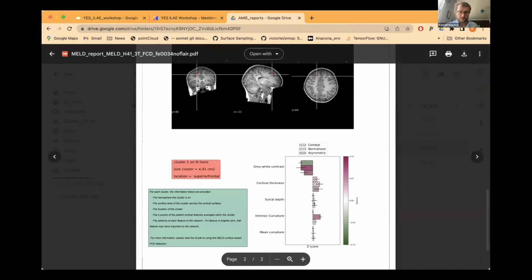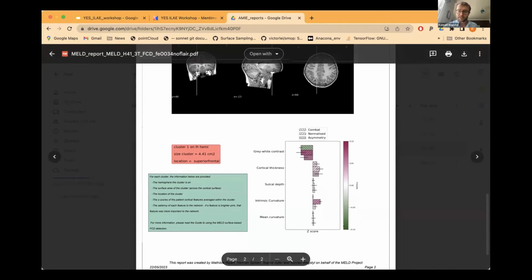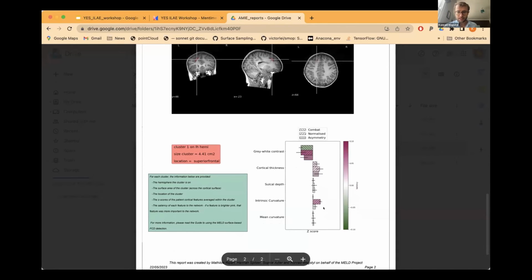And just to clarify, when you don't have FLAIR, you just don't see a FLAIR output. The classifier is designed to hopefully ignore the lack of a FLAIR and not produce any predictions for FLAIR features because they aren't there. So this is what happens if you just have a T1. Great, thanks to volunteers. Good question.